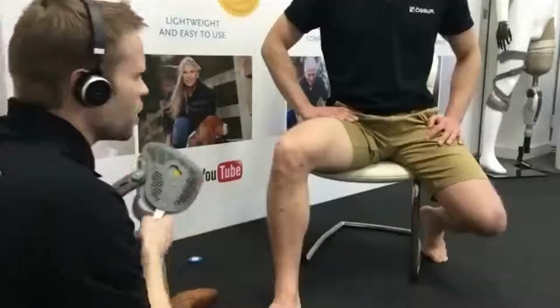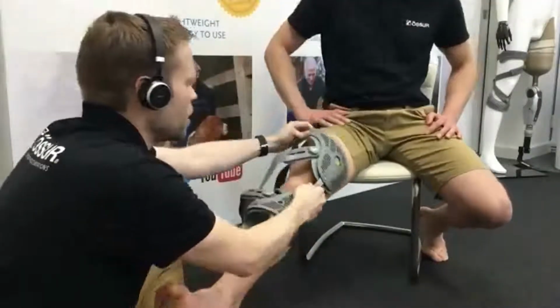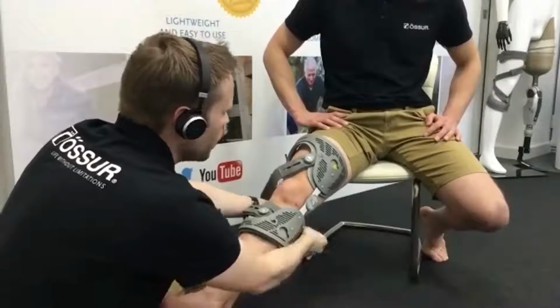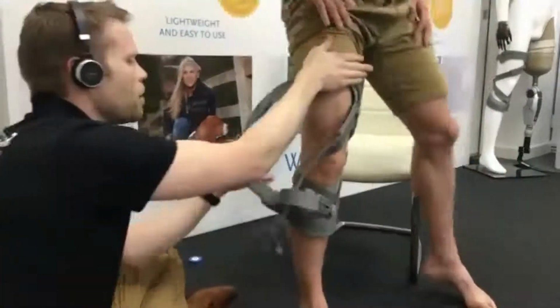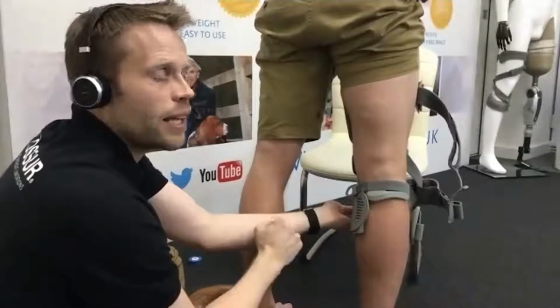Okay, we're starting with a straight leg, and we're placing this onto the leg like that. Strap into position, bringing this one round, and then clipping that one into position. So we're using that finger loop, and if we get Pete to stand, bring this one round, you can see that we've anchored it into position.